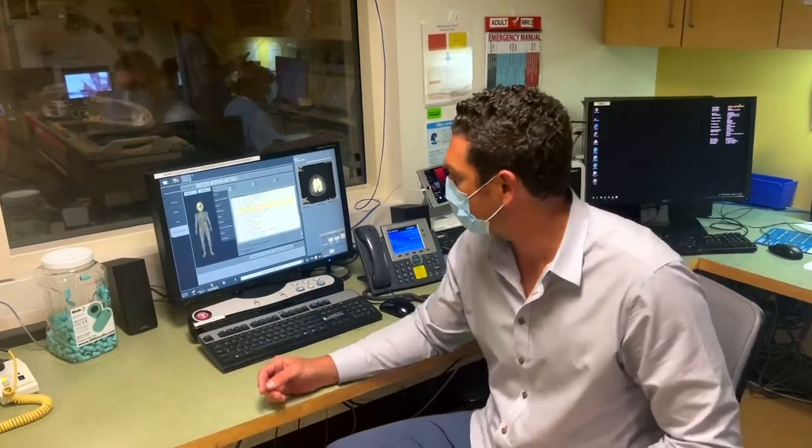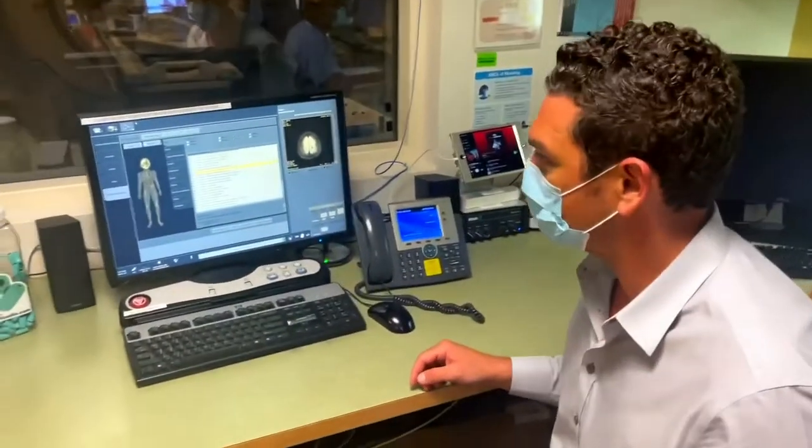Hey, my name is Spencer Howe. I'm at Massachusetts General Hospital at Ellison MRI, MRI number two. It's a GE magnet and I'm going to show you how the MRI audio system works.